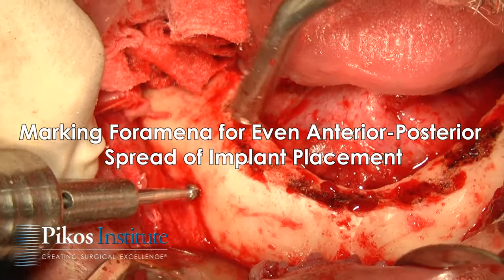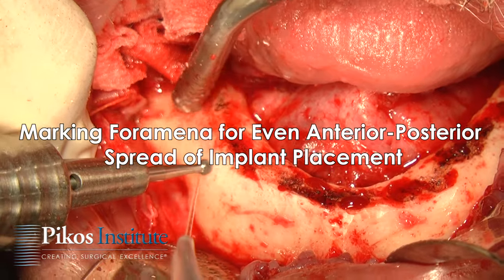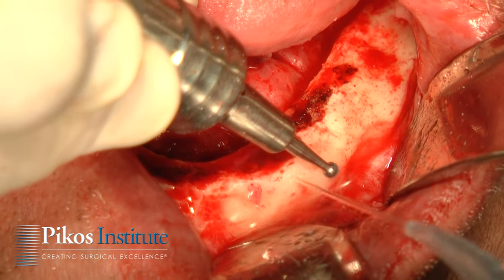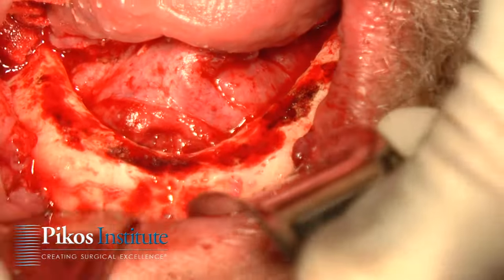Go ahead and put our number eight round on. We're going to mark where the mental foramina are as a guideline. This is a non-guided case, so we're freehanding the implants. Not a big deal with our bar over denture scenario — these implants do not have to be in a specific location. We want a nice anterior-posterior spread.